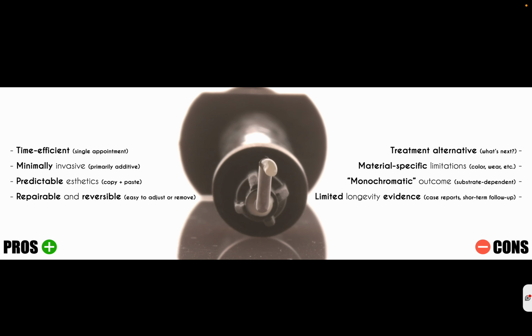What doesn't happen with the ceramics? Why? Because in the ceramics, you know that it's an indirect process that we need to send to the lab, and probably, if something happens, we have to completely redo the veneer or the crown or whatever.